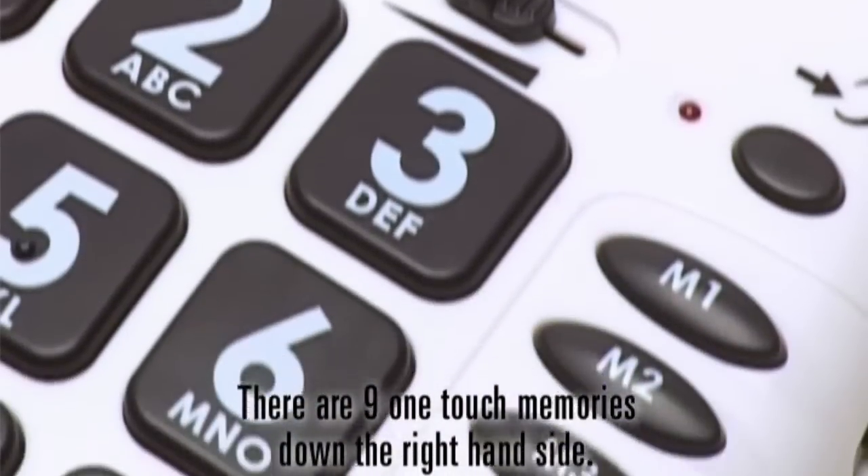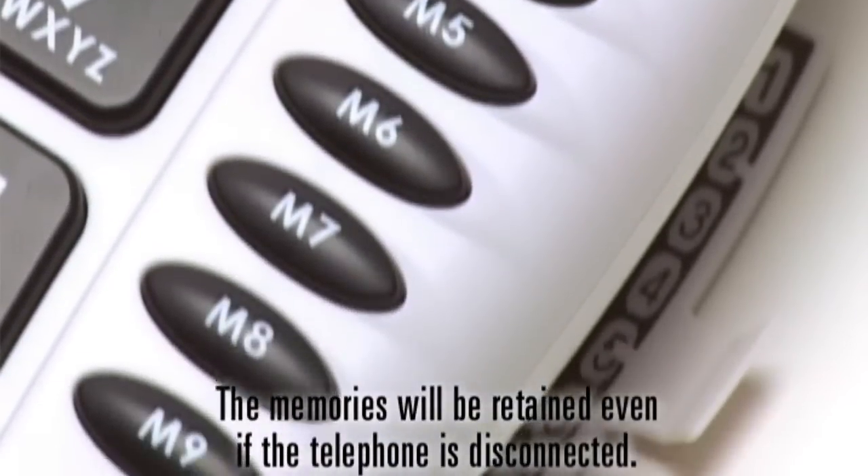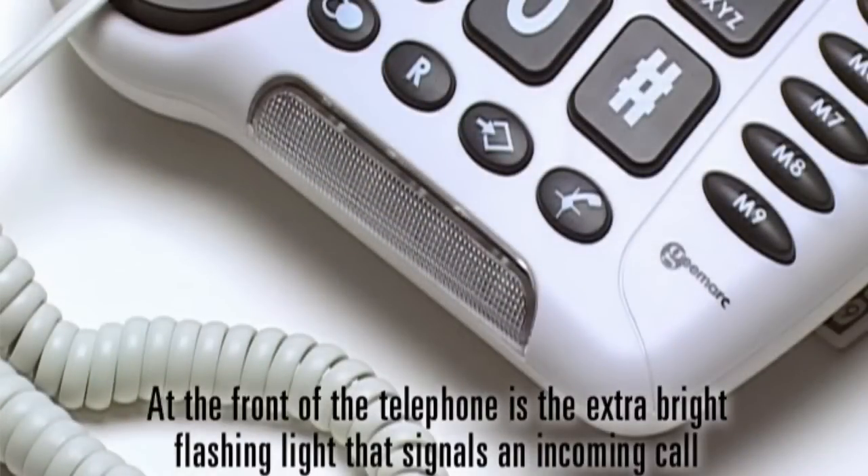There are nine one-touch memories down the right-hand side. The memories will be retained even if the telephone is disconnected. At the front of the telephone is the extra bright flashing light that signals an incoming call.